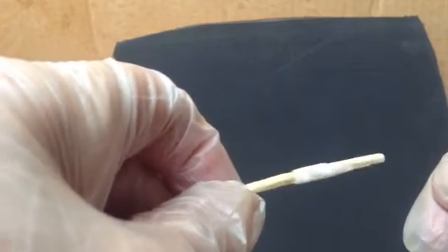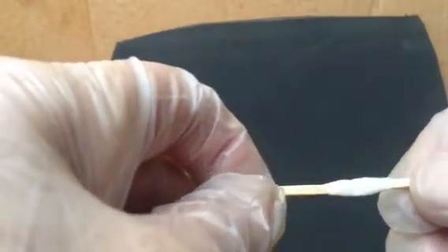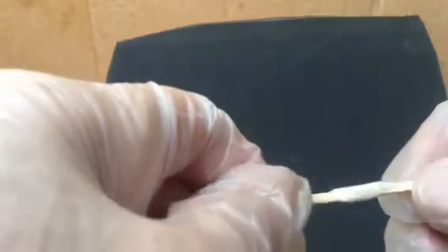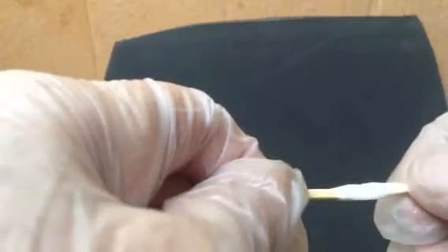Plates and screws wouldn't work here. There's no plate and screw small enough to work on a small bone under three millimeters in diameter. So that's one application for it.